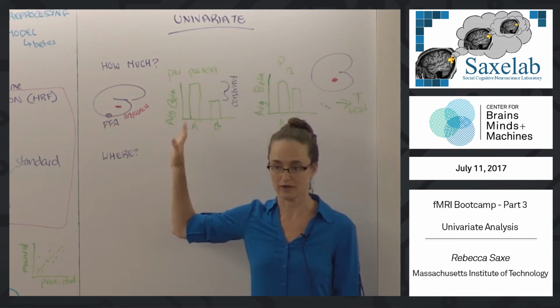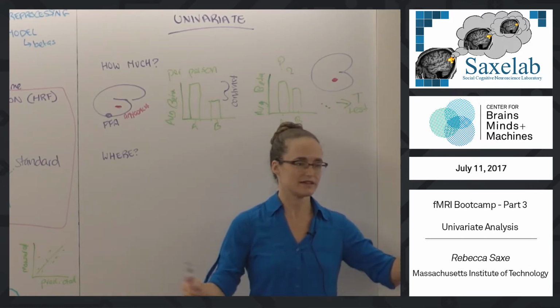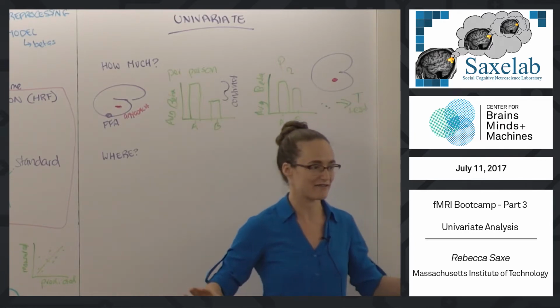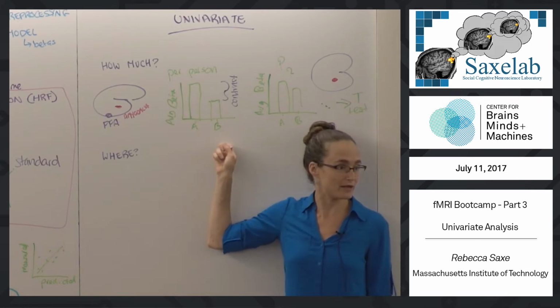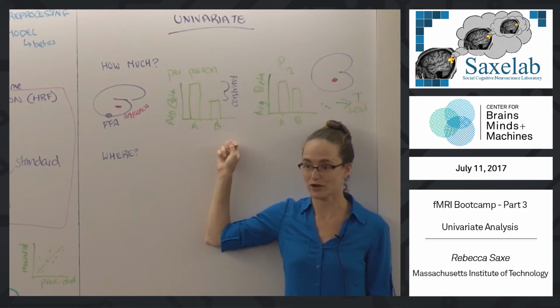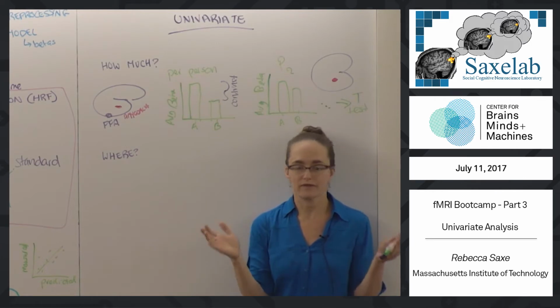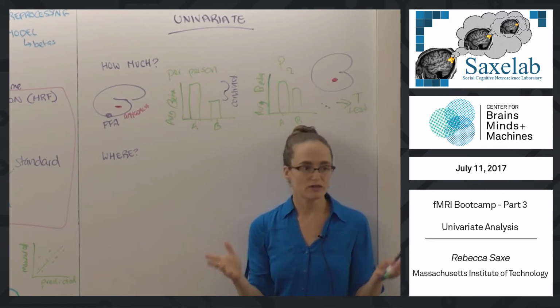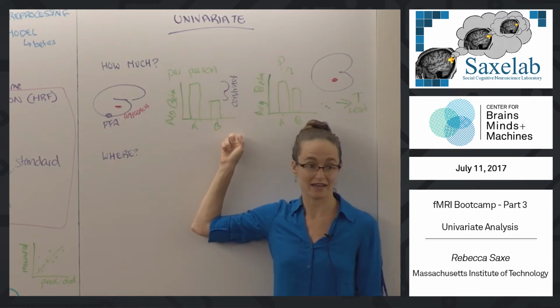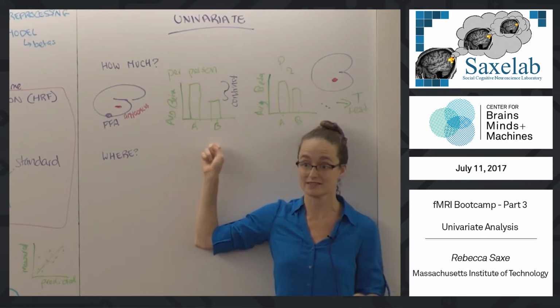So there was a good 10 years in fMRI where that was a sufficient question, how much activity, because then all of the excitement in fMRI is about designing A and B well, so that it's really interesting to know whether in some place the response to A is greater than B, right? And finding where to look. So for 15 years of fMRI, most of the interesting stuff was in thinking about where should I look and what experiment should I design such that it's interesting to know whether that brain region responds more to one of my conditions than the other?